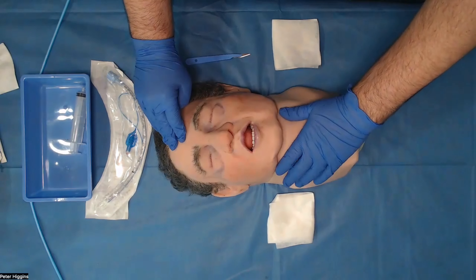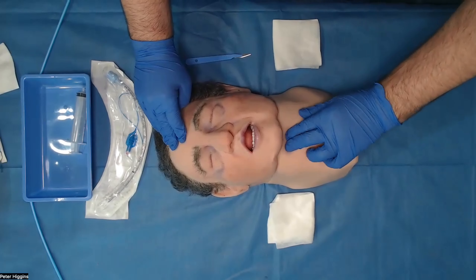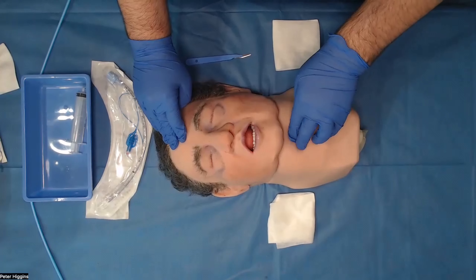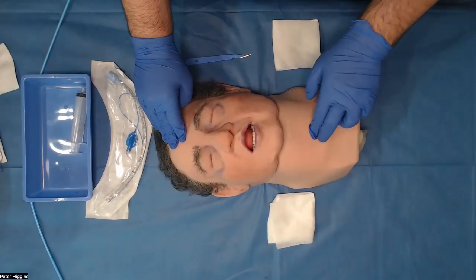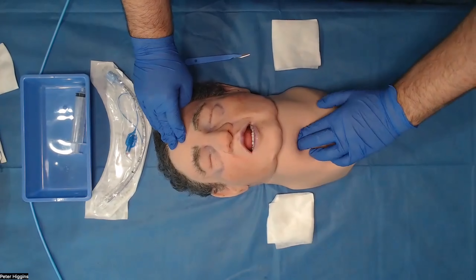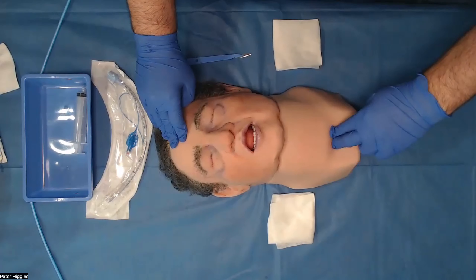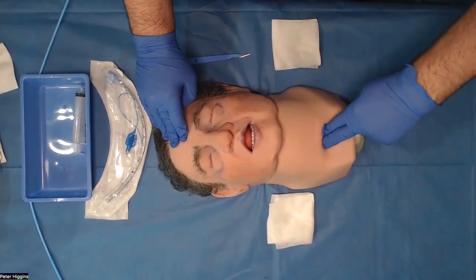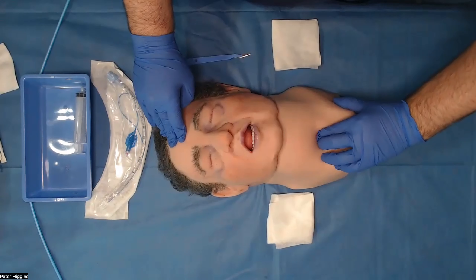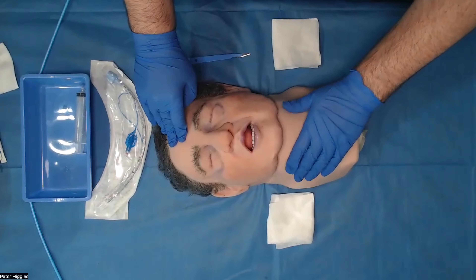First thing I'm going to try and do is perform a laryngeal handshake. I'm going to try and find where the anatomy is. Now this person obviously has a very raised BMI. So due to their obesity, their landmarks are very, very difficult to find. I can probably find the top of the sternum just about here, but I can't feel anything else.